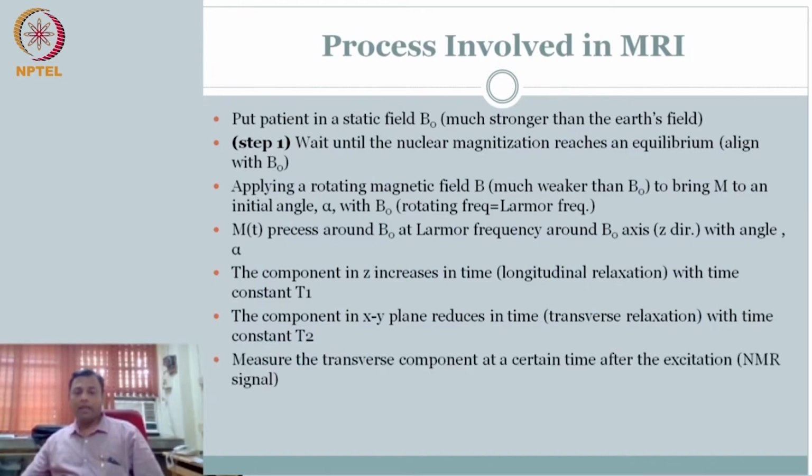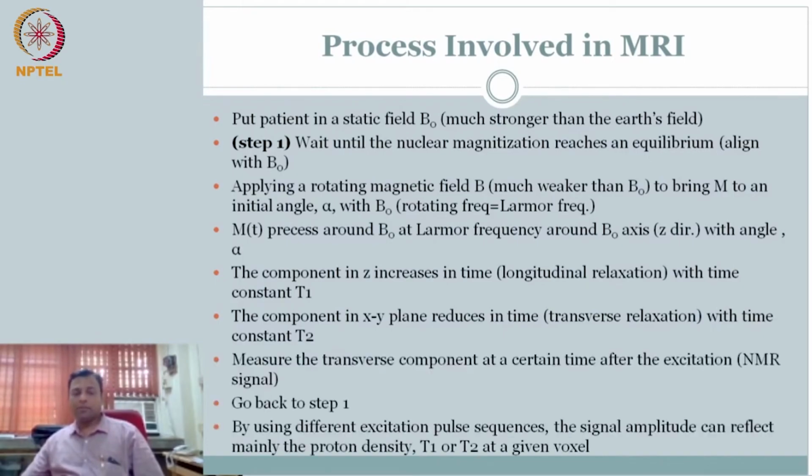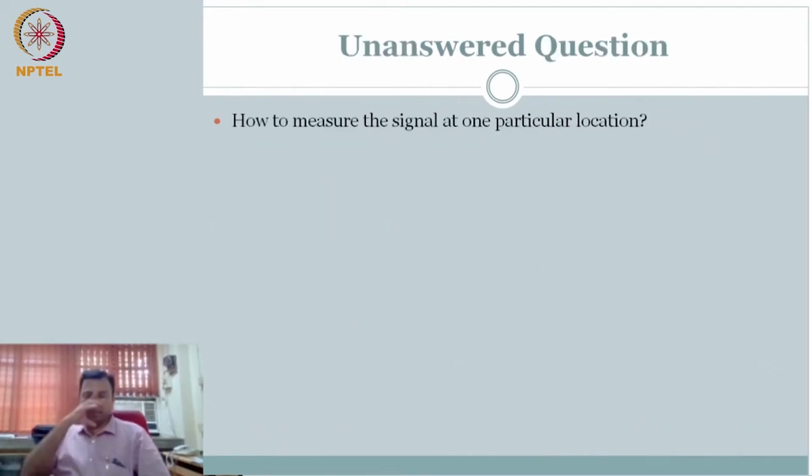Okay, so where we will jump is, despite me showing it here and asking you to review previously, we start answering this question. We have already covered all the physics. What is it missing? We are interested in MRI, we covered the physics part of it, we understood what the signal is, we understood the contrast mechanism. We also saw several images, but we didn't really answer the question.